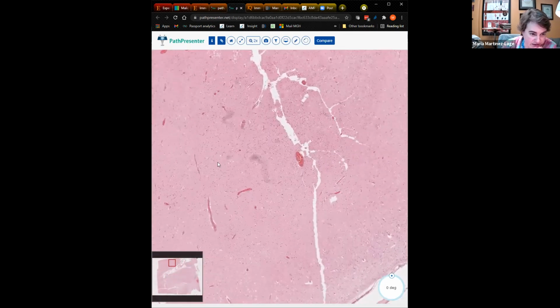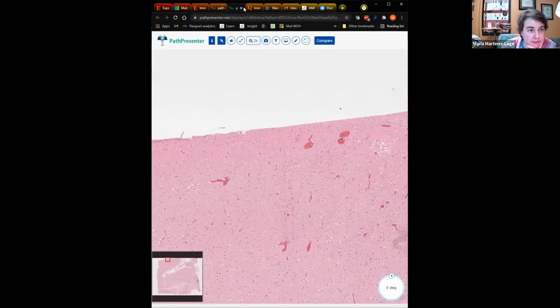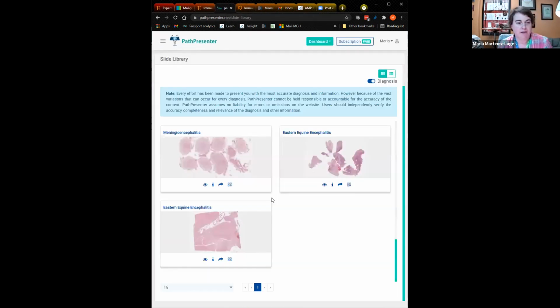But we saw all those features earlier in that other case of encephalitis. Okay.